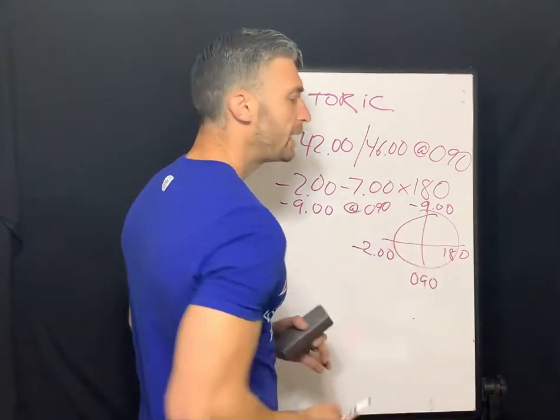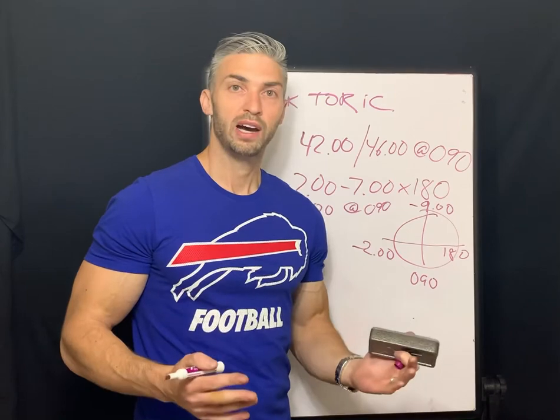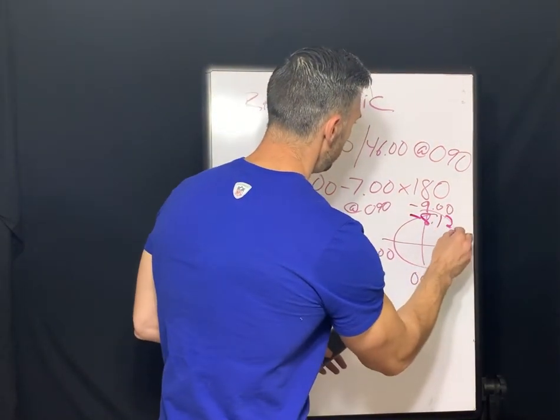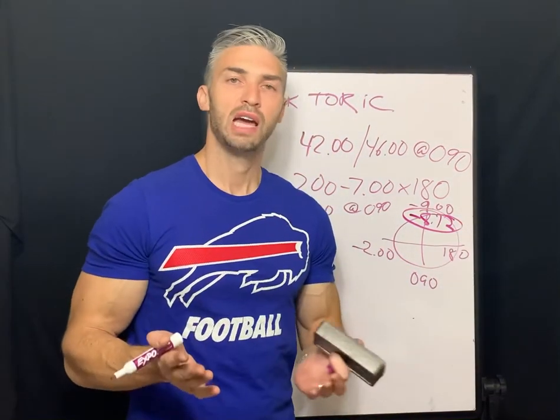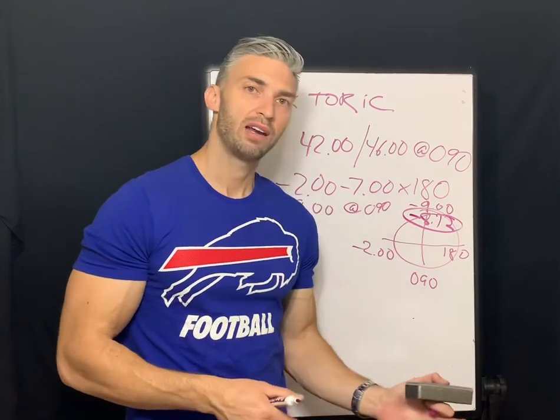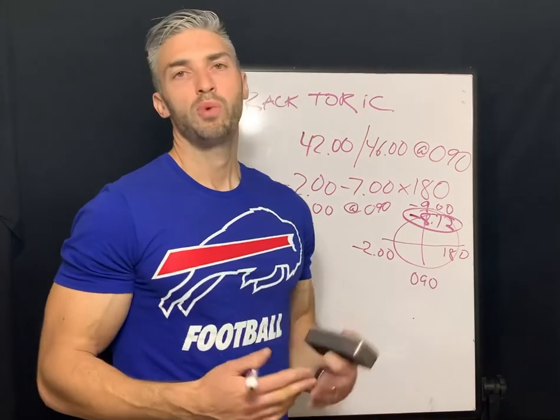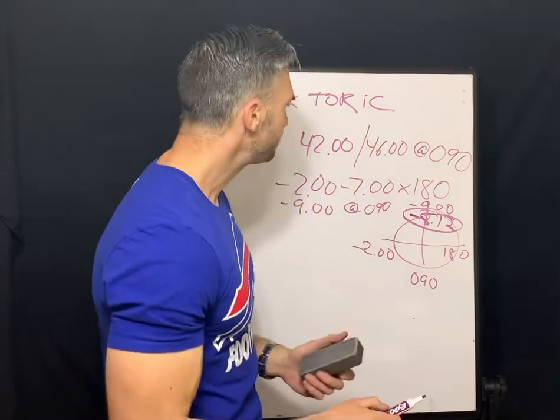So a -9, if we compensate for vertex distance, for the sake of this video, we're not going to work it out. It's -8.12. And again, there's multiple videos I have up on vertex distance. So I definitely implore you to go check those out if you need to refresh on that. But you could always, once you get used to it, kind of guesstimate about what it should be anyway to help you on the exam.